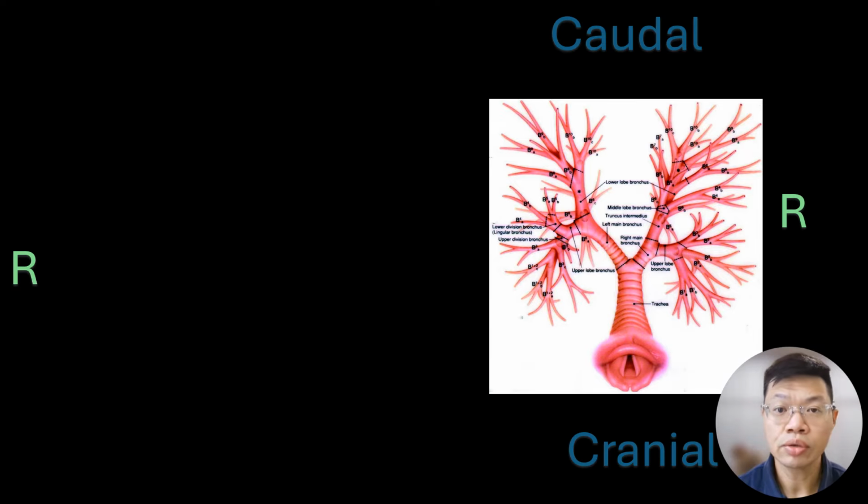It is crucial to understand the movements made by the bronchoscope, as we will need to mirror these movements in order to orientate the CT scan.